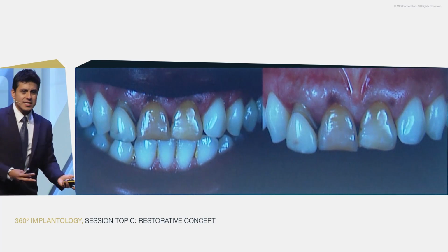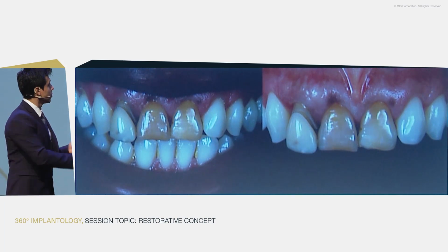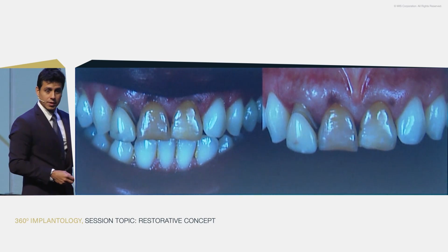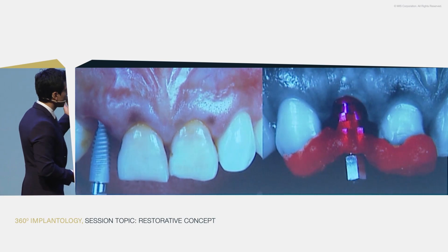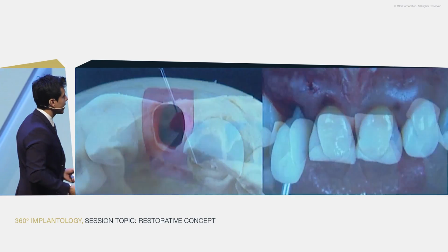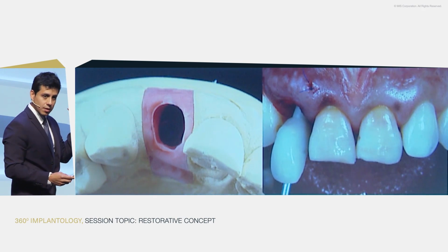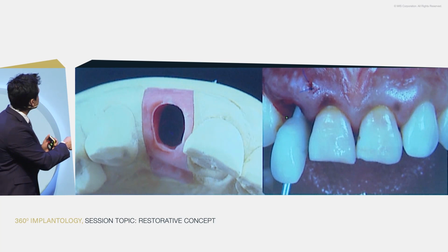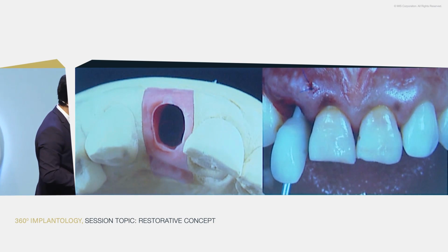Let's see a clinical case now in the anterior area. We have this kind of patient that will have to extract the lateral, and we have to place some veneers on the anterior area. So we remove the lateral, we did our jig with wings, we provide alveolar model, we made that provisional following the rules that we mentioned before, and using this way the plastic cylinder provisional that MIS has.